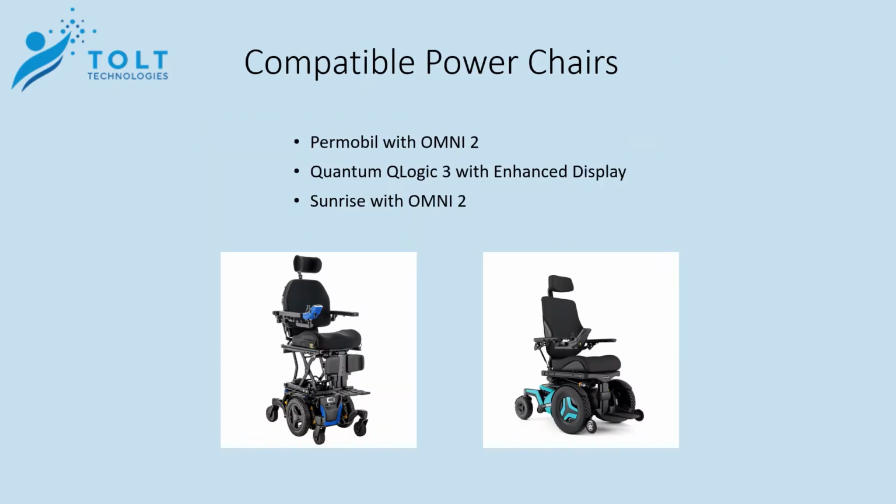What chairs are compatible with Ability Drive? The Permobil with an Omni 2, the Quantum with a Q-Logic 3 with an enhanced display, and a Sunrise with an Omni 2.